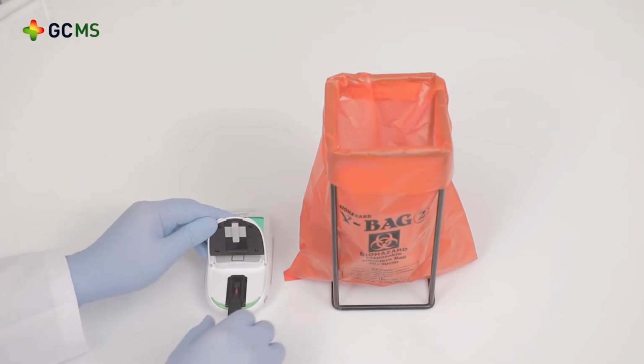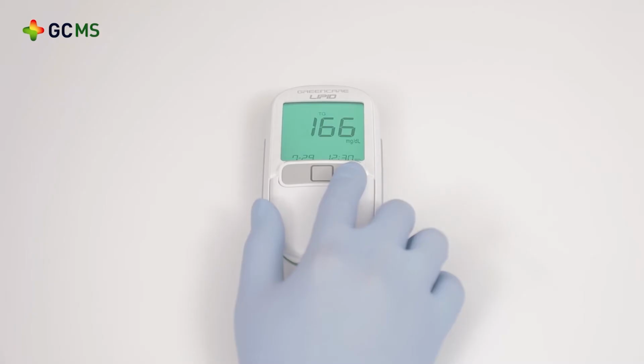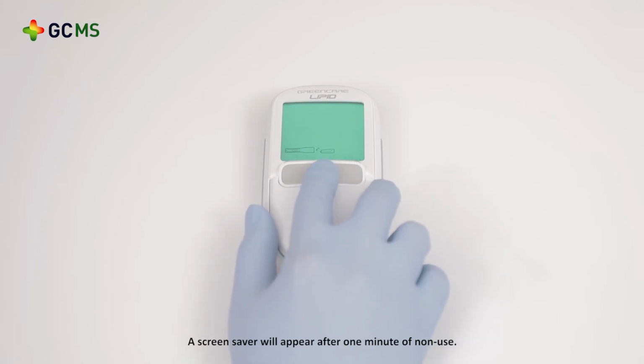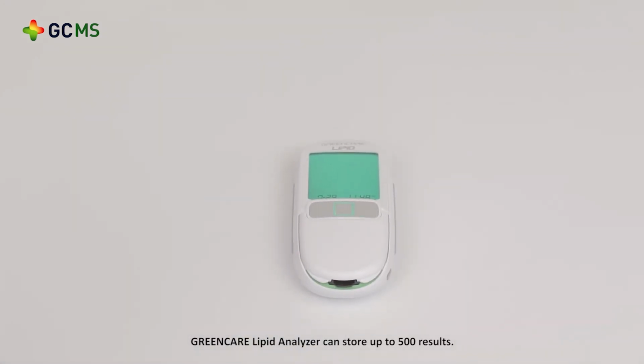Then remove the used test kit from the analyzer by pulling it out and dispose of it. Close the cover manually when the analyzer is not in use. A screensaver will appear after 1 minute of non-use. To reactivate it, just tap the screen with your finger. GreenCare Lipid can store up to 500 results.